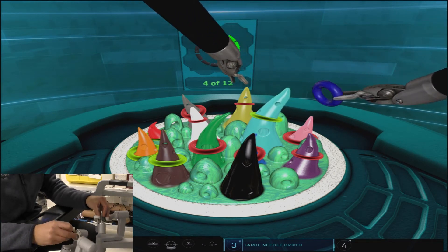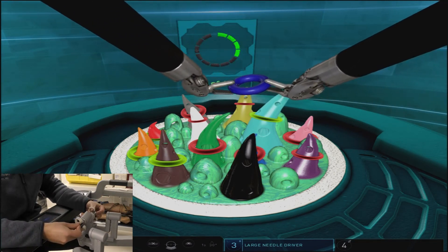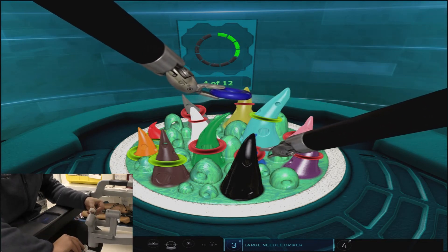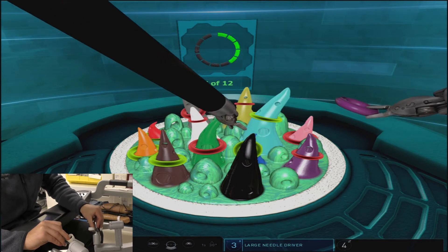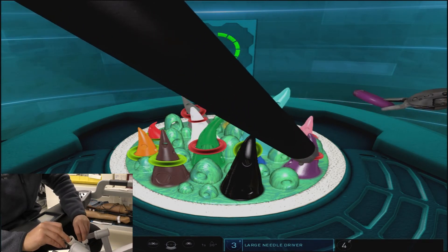You'll see that we pass the blue ring off to the left arm in order to remove the incorrect ring from the tucked behind blue cone, because the right arm had the best approach towards it without causing any collisions.